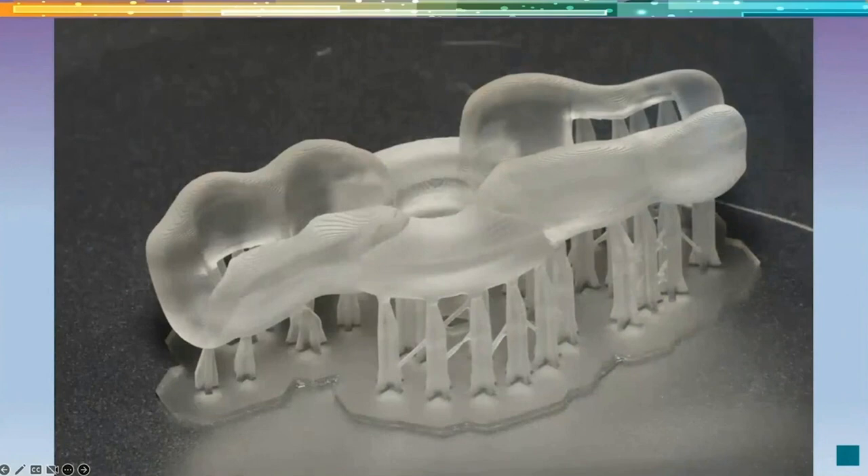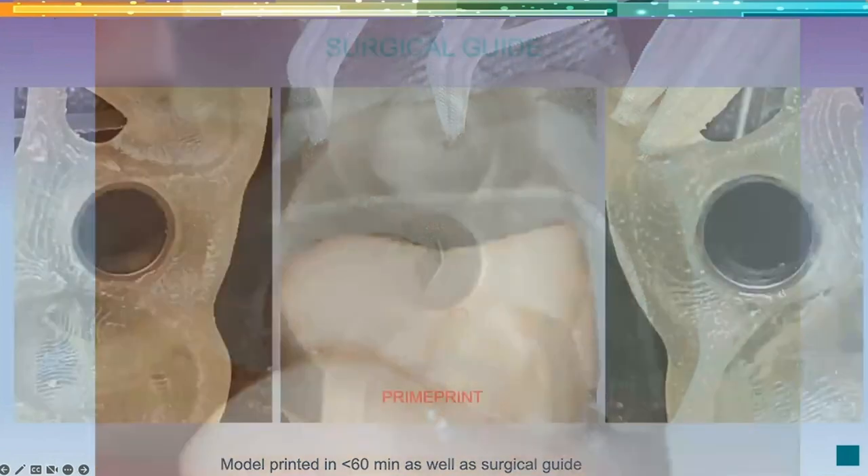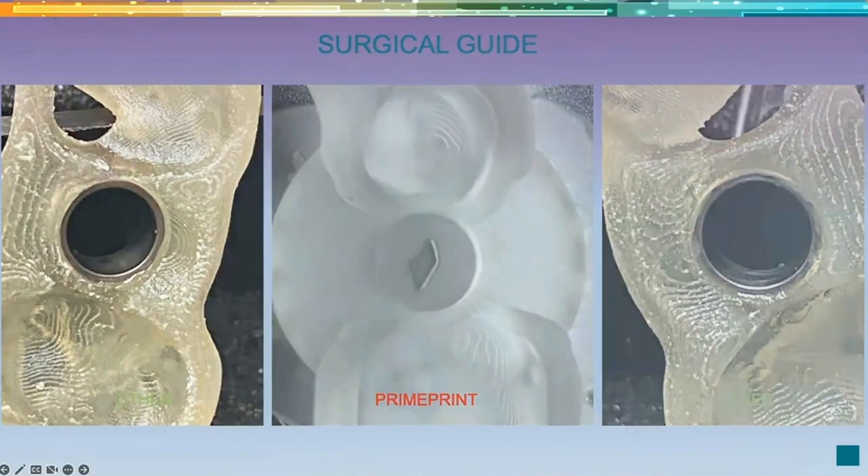Here's what the printed surgical guide looks like — really beautiful. It approximates to our fast-print model, showing how accurate the guide is. To compare, on the right and left are our old milled units — not horrible, but about five to ten times more expensive. We're saving money doing this, and we can handle more than one implant. Lots of design services online can develop these surgical guides, and then you just import the STL and print them.